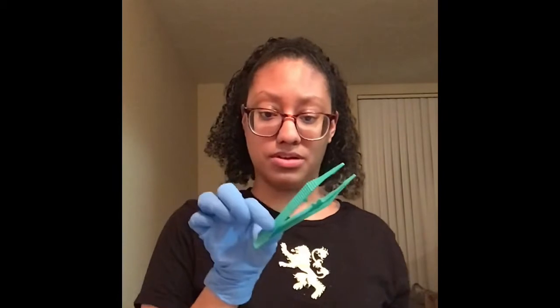Now that we have our sterile drape, we are going to put our supplies onto the drape. So I'm going to grab my tweezers, my tape, my 4x4s, and my ABD pad.